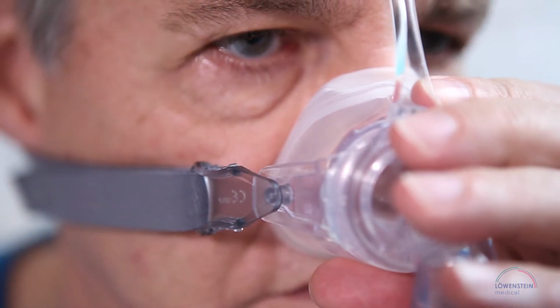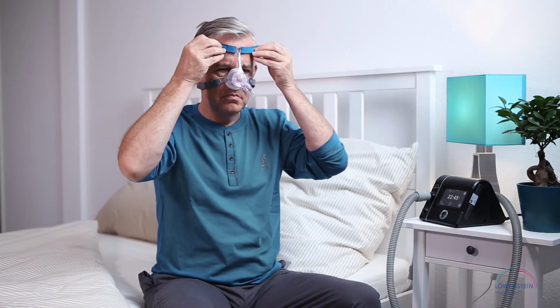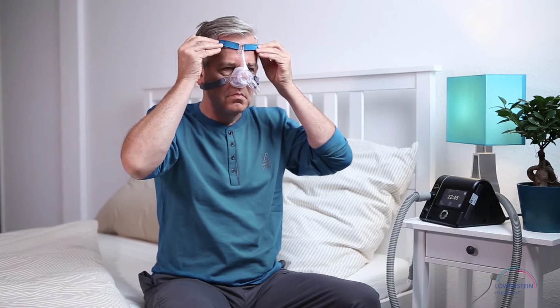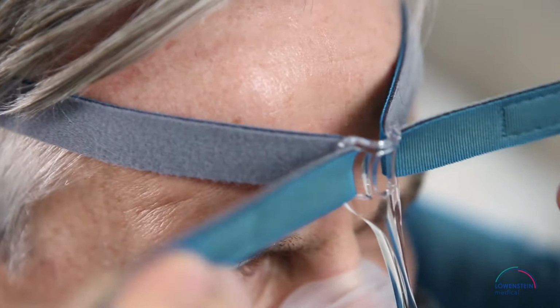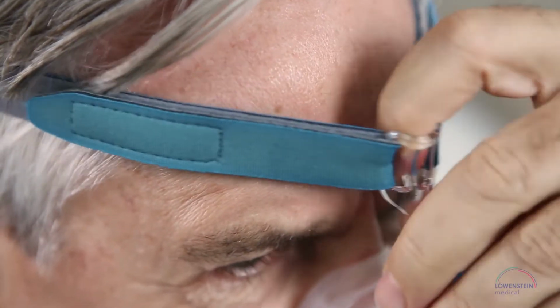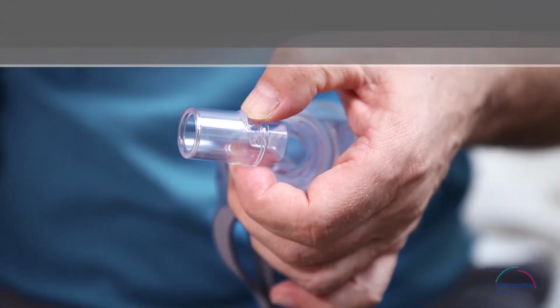To fit the headgear to your head, first loosen the upper hook and loop tabs on both sides. Pull the tabs backwards at the same time until the mask sits comfortably and not too tight. In most cases, the upper portion of the forehead support lies lightly or not at all on the forehead. Finally, you can tighten the lower straps by pulling them backwards.